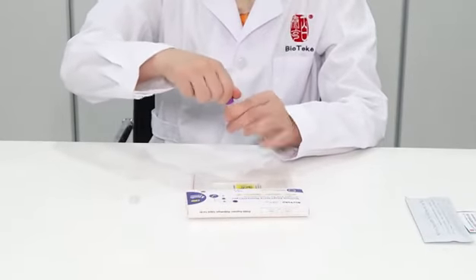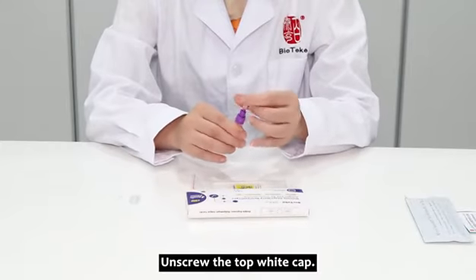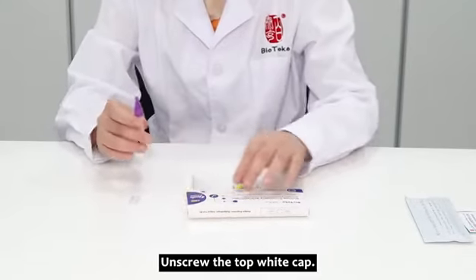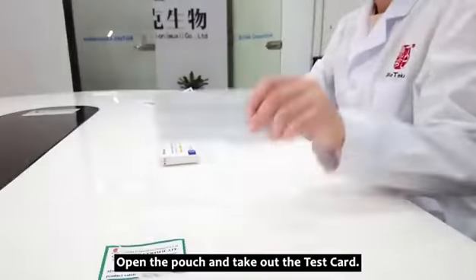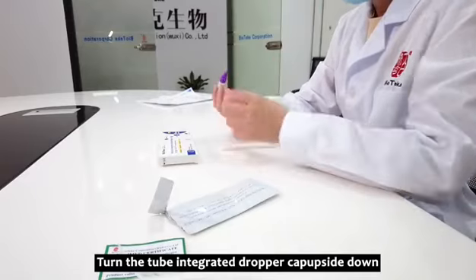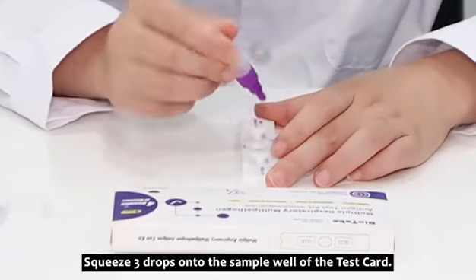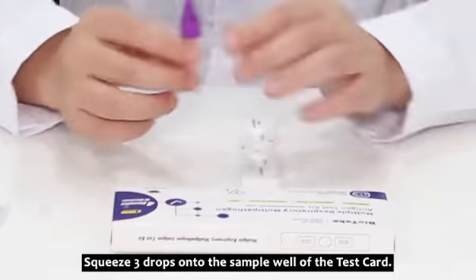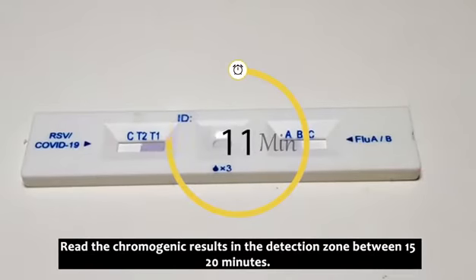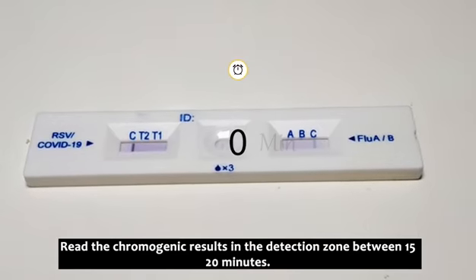Screw the purple tube cap onto the sample tube, then unscrew the top white cap. Open the pouch and take out the test card. Turn the tube integrated dropper cap upside down and squeeze three drops onto the sample well of the test card. Read the results in the detection zone between 15 to 20 minutes.